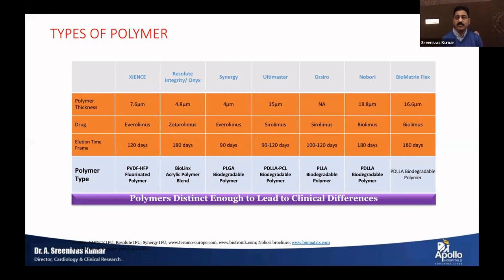The albumin gets deposited on those polymers and it doesn't allow the platelets to stick onto that polymer. That's how, I think, some of the studies which came showed the latest version of drug-coated stents fared better than the bare metal stents, surprisingly. On follow-up, when they were trying to see the reasons, that was probably the reason by which these drug-eluting stents became thromboresistant.